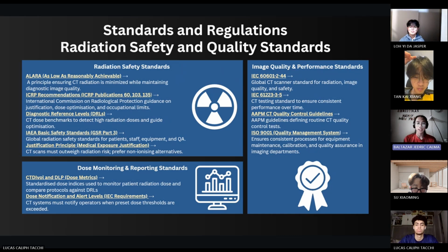In summary, DICOM, HL7, and radiation standards work together to ensure CT imaging is safe, accurate, and efficiently integrated into clinical practice.